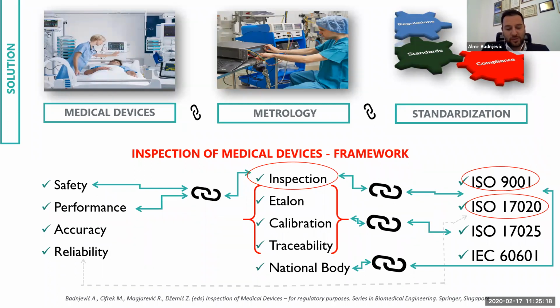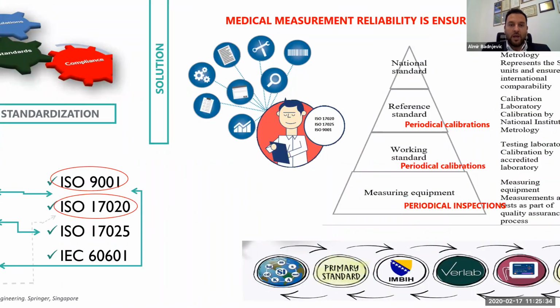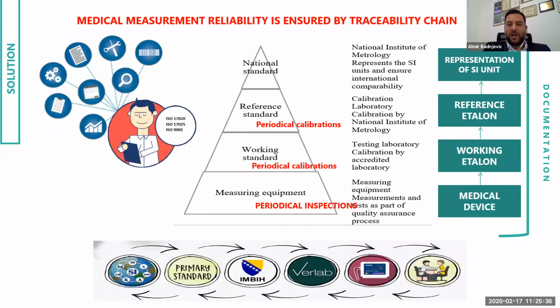Now, when we introduce this to the medical device regulation and the new norms which are presented here, all of those activities will be performed by the laboratories, which will be under the national bodies, in fact the notified bodies of each country. What are we getting here? We are getting, in fact, a traceability chain.